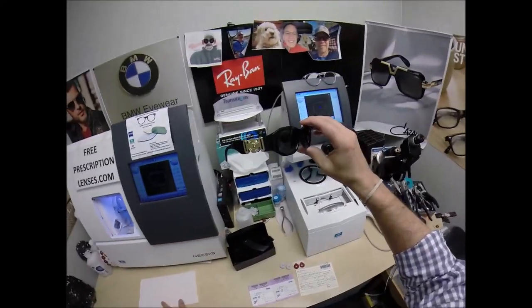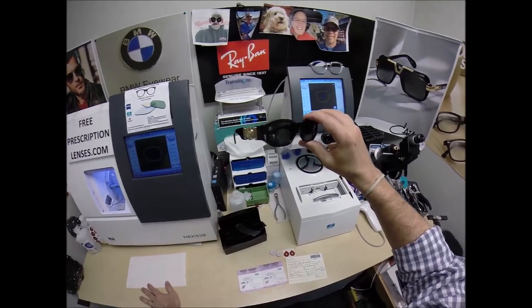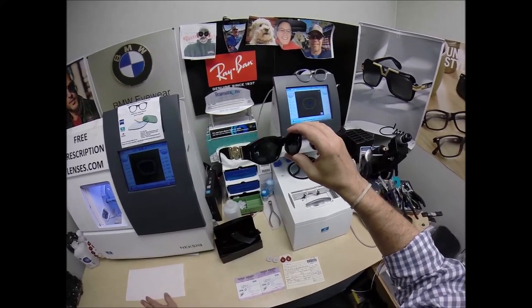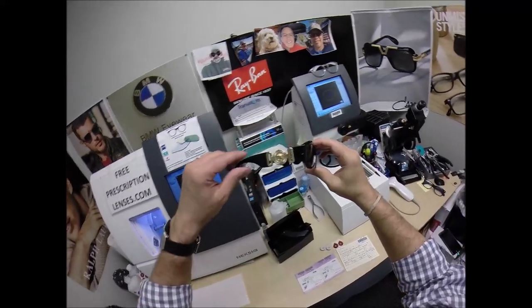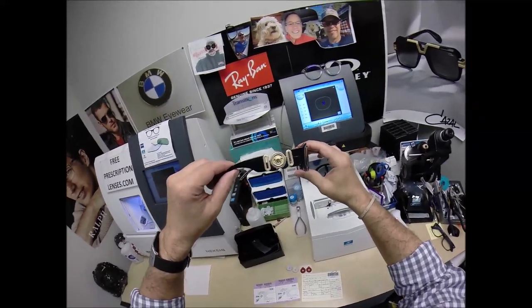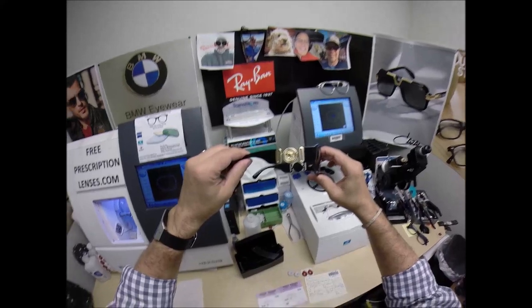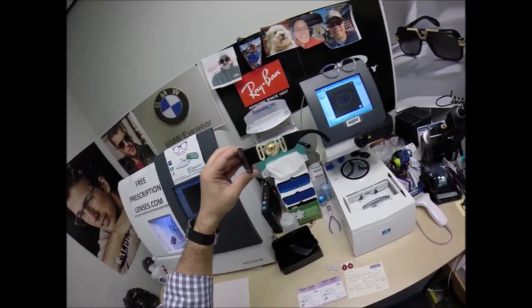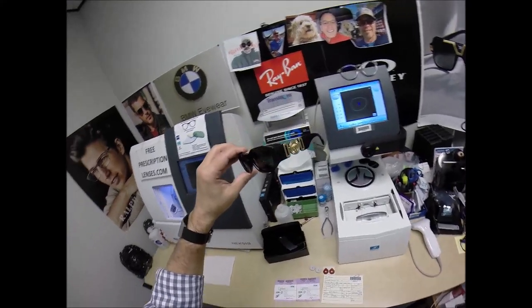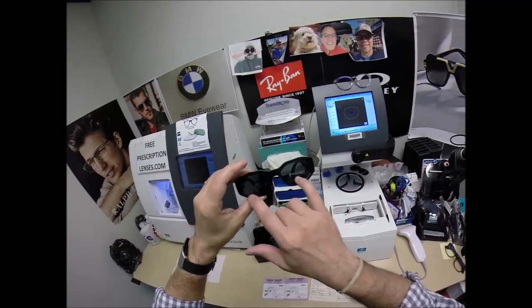This is a men's frame that comes in some bold colors. You see the black, the classic tortoise, a solid white, a solid yellow, a solid orange, a solid fuchsia — men are wearing some colors. And of course the classic black and gold. But let me pop out the original demo lenses, one of which says Versace.